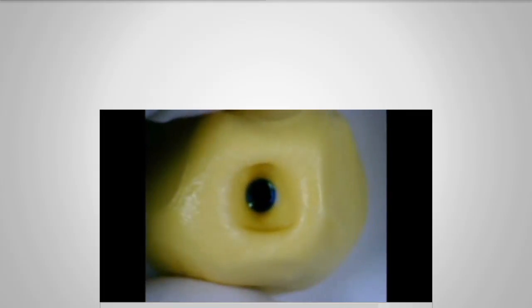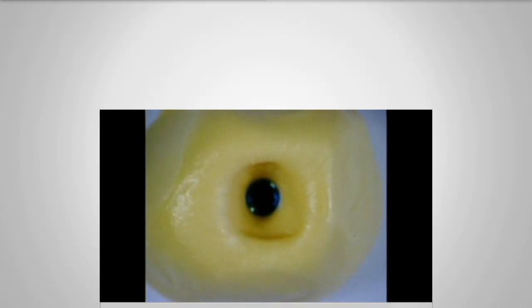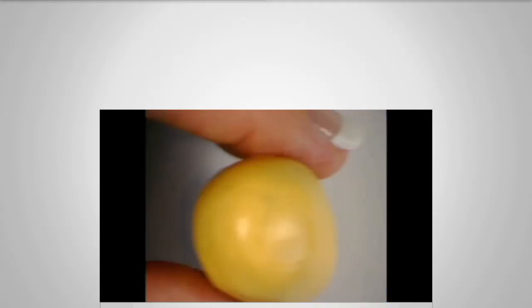And there's the form that you've developed. Let me see another question. If the acrylic gets into the osteotomy that's prepared, then it is harmful for the gingival area, or bad for the gingival growth towards the gingiva. The acrylic gets into the osteotomy. And if you get fresh, unset acrylic down there, it sets below the tissue, not as part of the provisional restoration. I can see where that would be harmful. But your polished provisional restoration, whether it's acrylic or your bisacryls, is not harmful to the soft tissue.